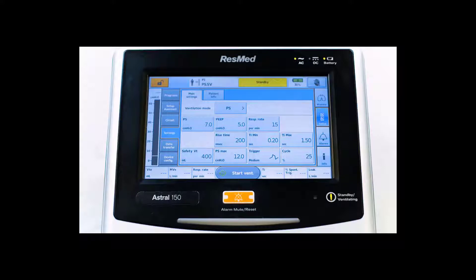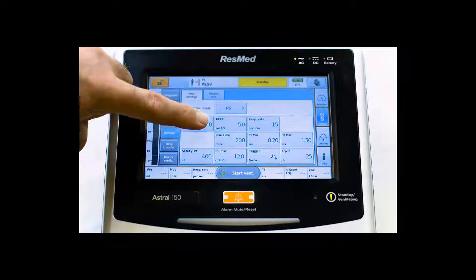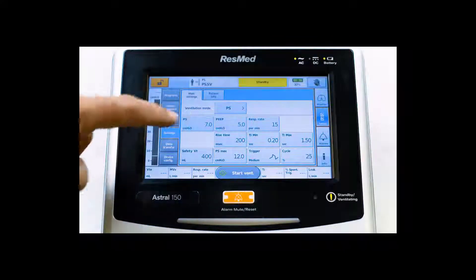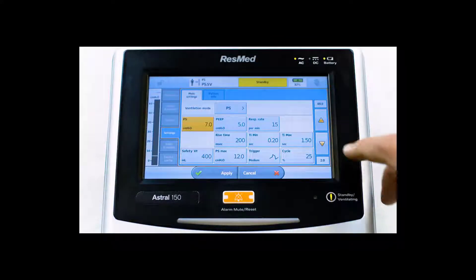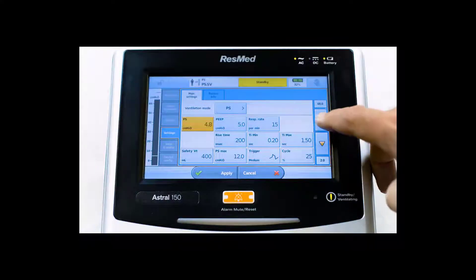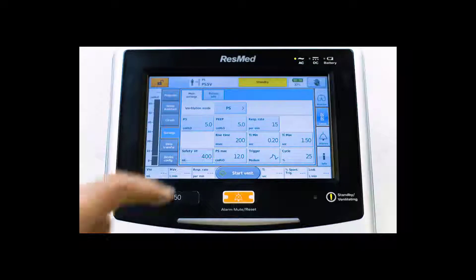For the other settings, generally speaking, you will start out with a PEEP setting of 5 unless the patient has previously been on another prescribed EPAP setting. Minimum and maximum pressure support ranges are traditionally 5 to 20, so you will have a minimum pressure support of 5 and maximum pressure support of 20. Please note these settings must be prescribed by a physician.